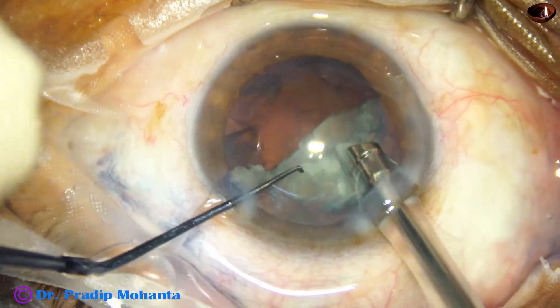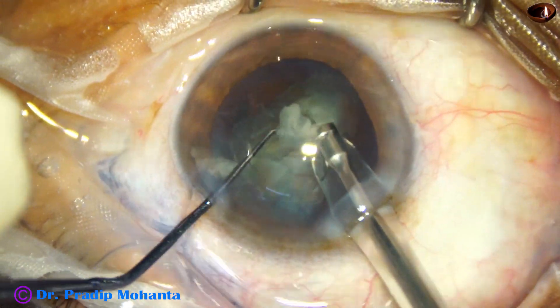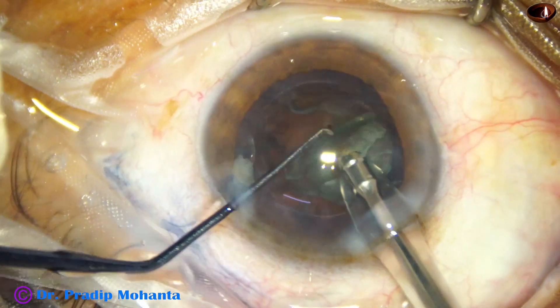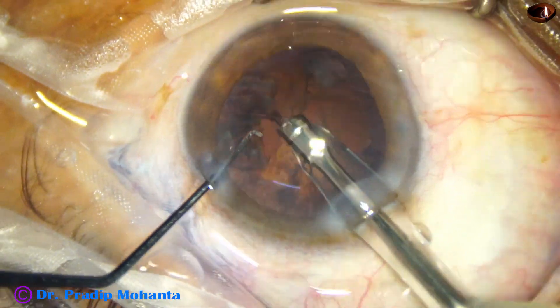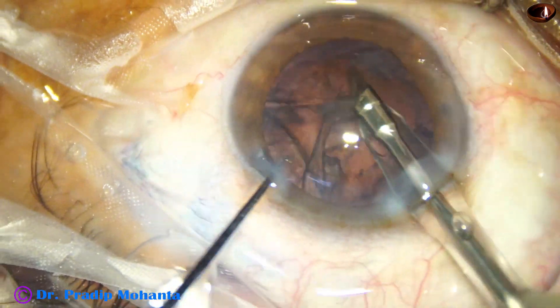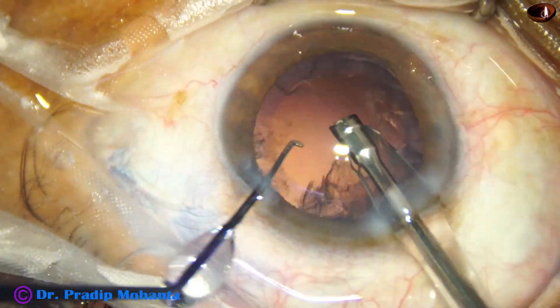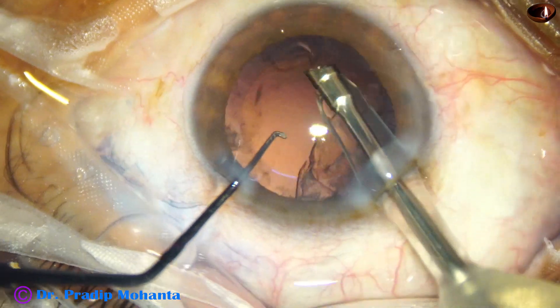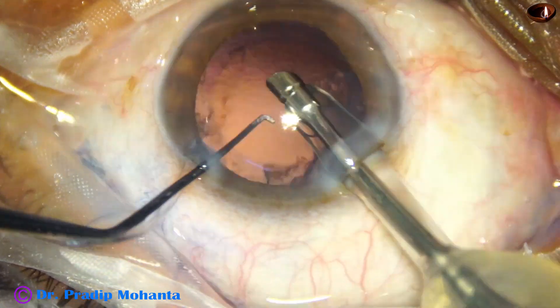When we do the trench, vacuum is very low, about 80 mmHg, and flow rate is 20 to 25 ml per minute. Ultrasound is set according to the hardness of the nucleus — in this case, it was 60 percent. When we emulsify the pieces, ultrasound remains the same, but vacuum is increased to about 400 mmHg and flow rate is 40 ml per minute.